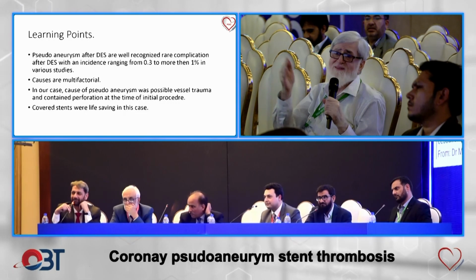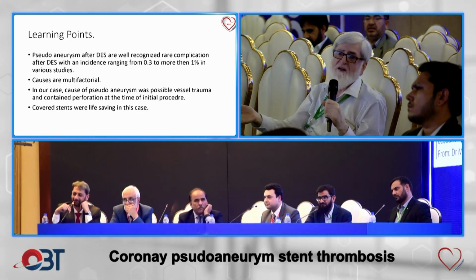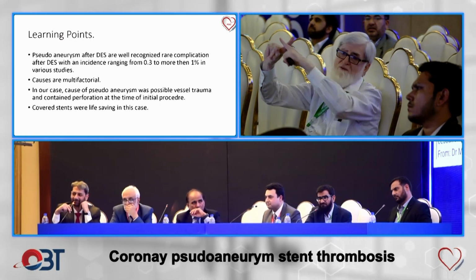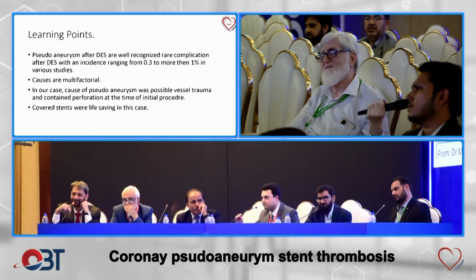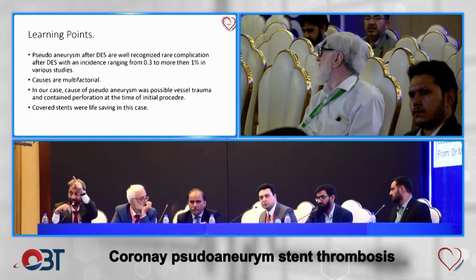The other thing was whether this was aortic or into the LV outflow or right outflow. So this is crisscross. If it is going this way, it is LV outflow. If going this way, this is RV. Very right. I think he has one more comment to make as well, please. So totally agree.